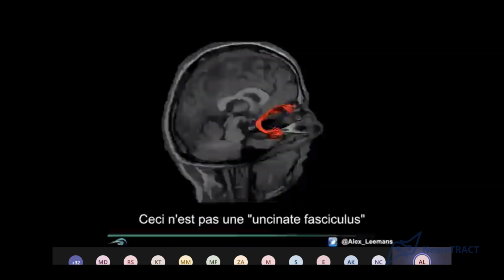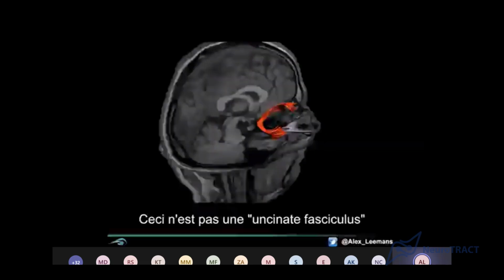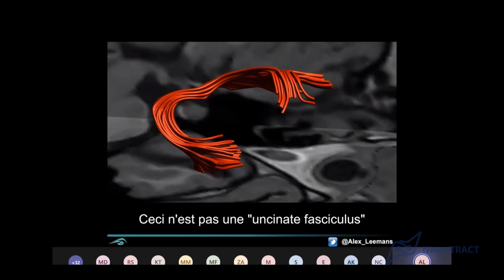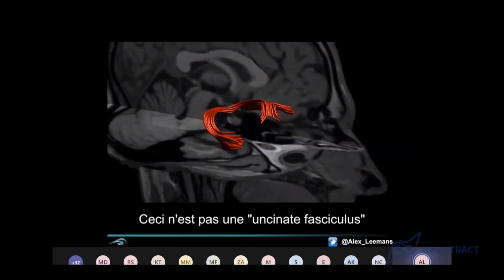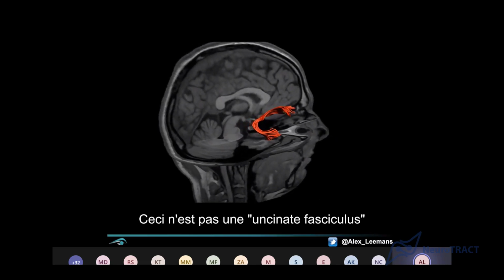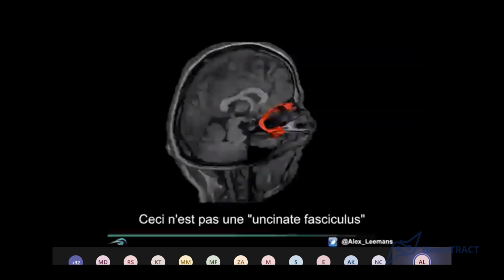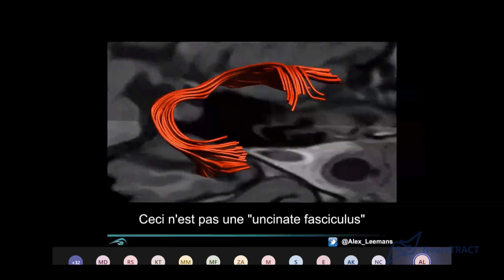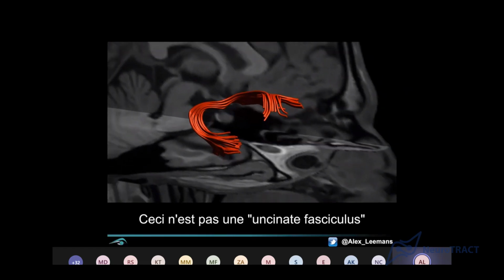But, and this is a big warning, "Ceci n'est pas une pipe," we all know the art, but the same holds for fiber tractography. Some people also find it a bit artistic, right? They say like, oh, nice tracts. Well, you have to be careful about calling them tracts.